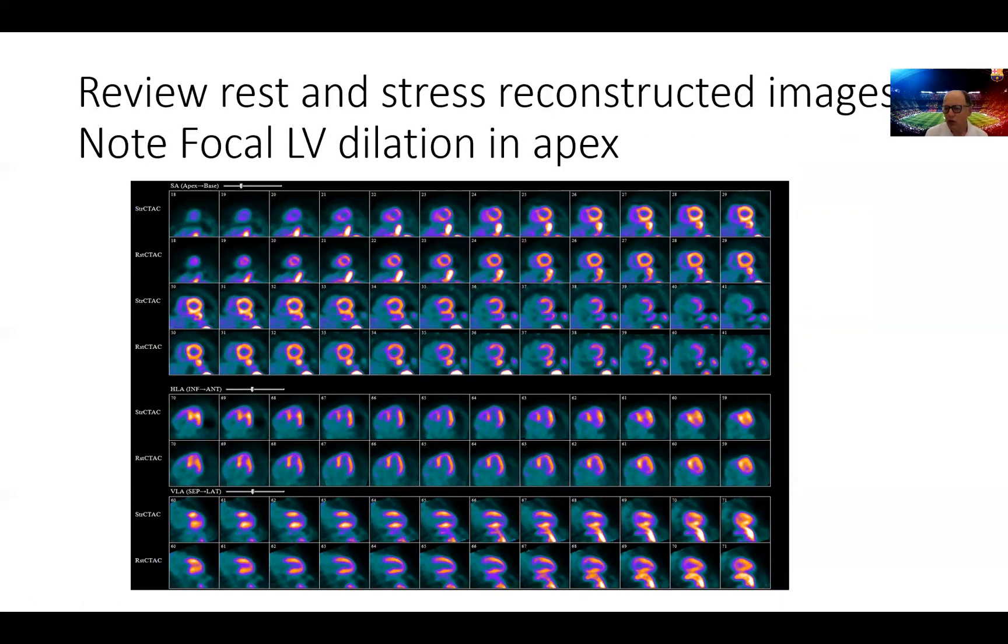All these are signs of high risk and more representing multi-vessel coronary disease. So again, note, this is extremely important, the dilatation of the left ventricle and the increased RV uptake from the rest of the stress images.